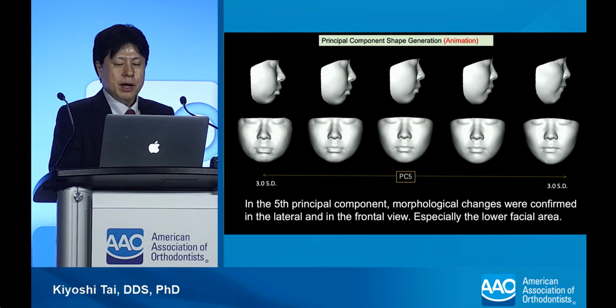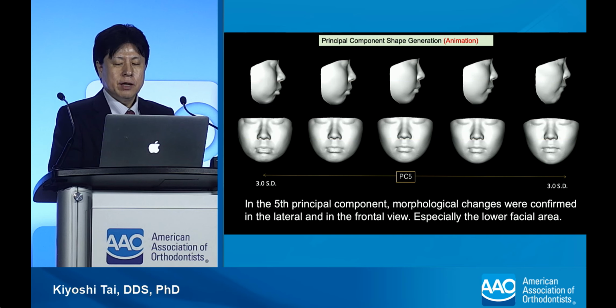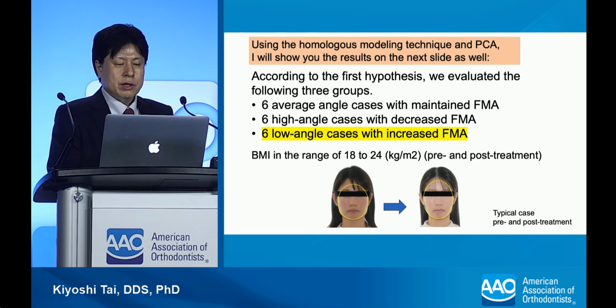Please allow me to add something about PC5 here. Morphological changes were confirmed in the lateral and frontal view, especially in the lower facial area. Finally, six low-angle cases with increased FMA. I will show you the result on the next slide as well.